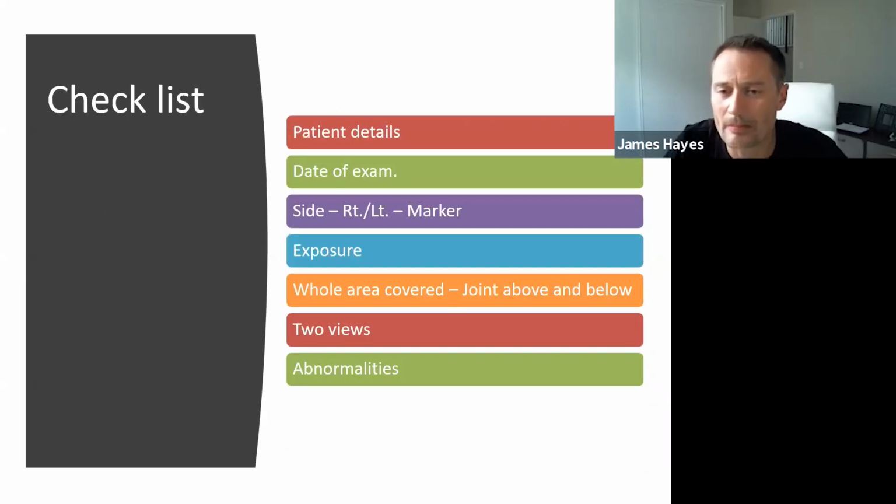Right, so this is the legal stuff, all right? The first bit is, anyway, you have to check the following things. Now, it sounds silly, but when you're working on the ward, depending on how many patients you have, and especially now that all of your images are coming on the computer, someone can walk, you know, if you're looking at a chest x-ray, which is probably 90% of the images that get sent to the ward.